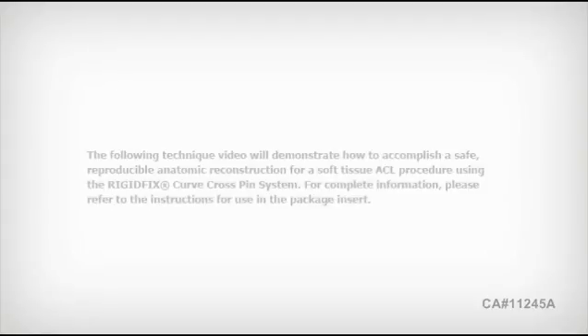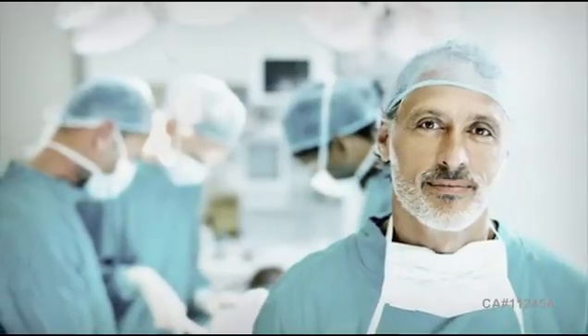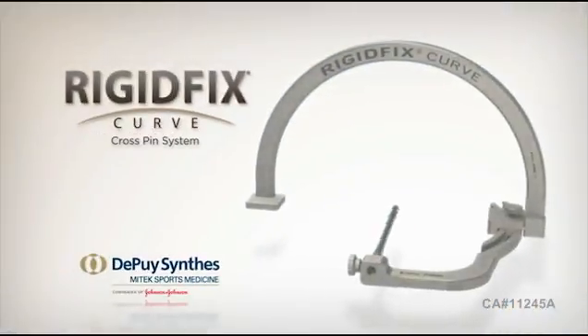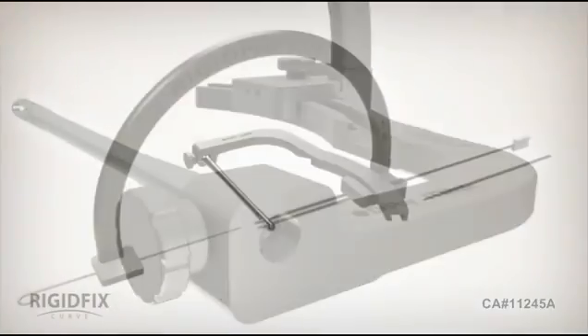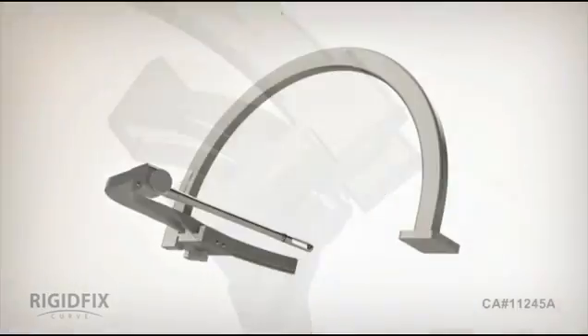The following technique video will demonstrate how to accomplish a safe, reproducible anatomic reconstruction for a soft tissue ACL procedure using the RIGIDFIX Curve Cross Pin System. For more than a decade, orthopedic surgeons have relied on the RIGIDFIX Cross Pin System for strength and rigidity in their ACL reconstruction procedures. Today, with the newly designed RIGIDFIX Curve Cross Pin System, surgeons are able to achieve a more anatomic reconstruction through the anteromedial working portal while realizing the intrinsic qualities established by the first generation RIGIDFIX.